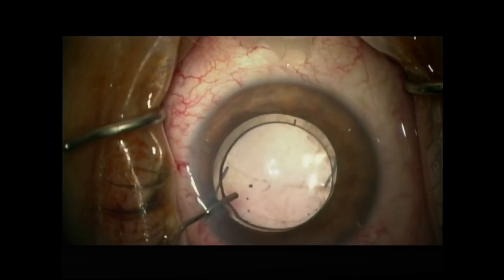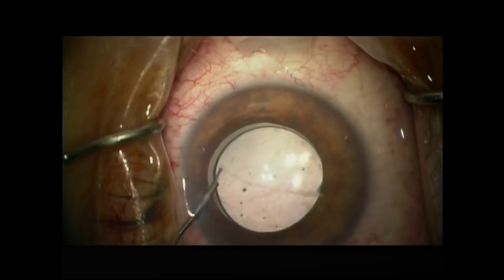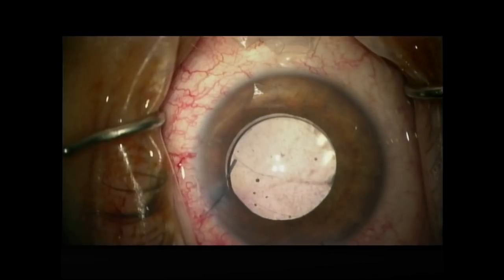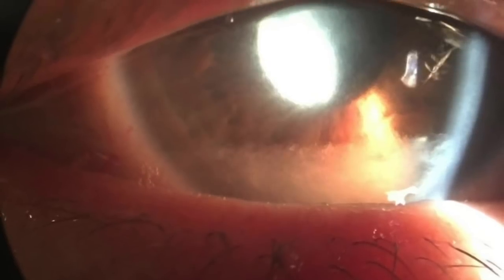The patient was then seen the following day and his pressure had returned to normal. He later underwent a retina procedure to remove the nuclear fragment in the vitreous cavity. And this is our case of emergent cataract surgery for acute lens particle glaucoma.